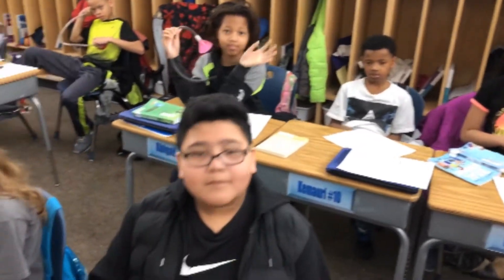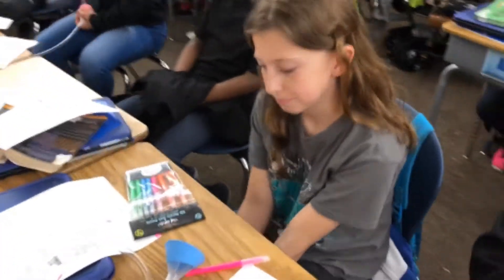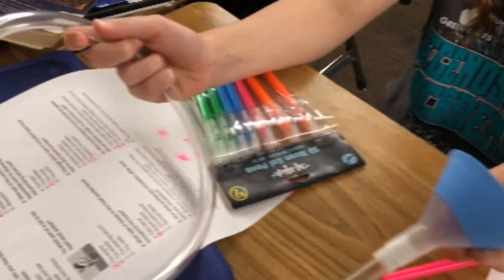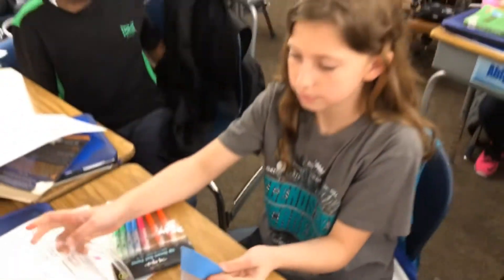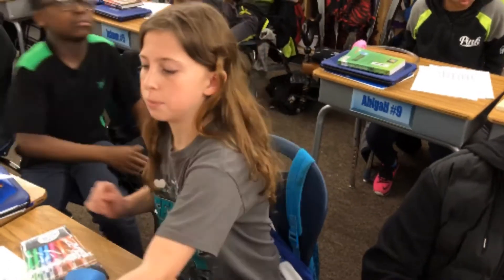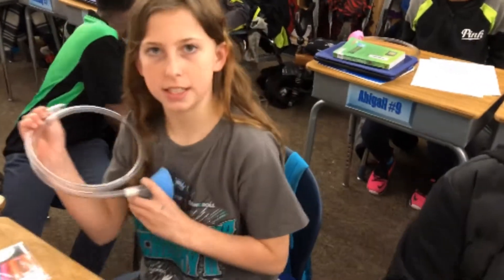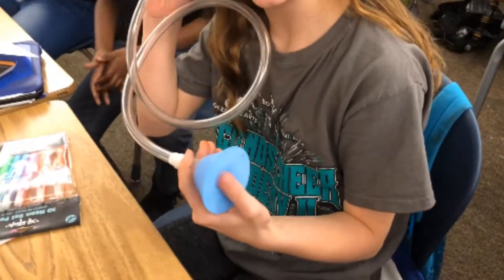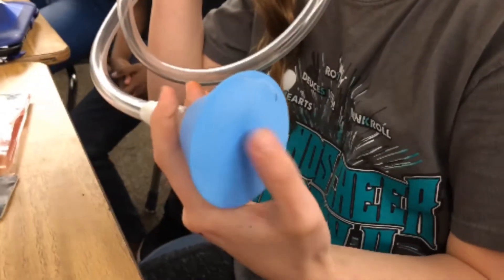Welcome back to Ramsey land. We're learning about the circulatory system and we have created homemade stethoscopes to get our heart rate. It looks like we've got a balloon, a funnel, and some PVC pipe. Kaylee, how does that work? You put one end in your ear and this end next to your heart — the balloon is stretched over the opening of the funnel.